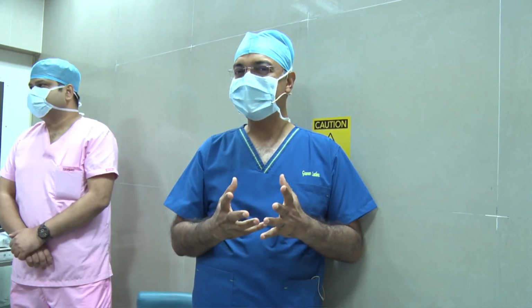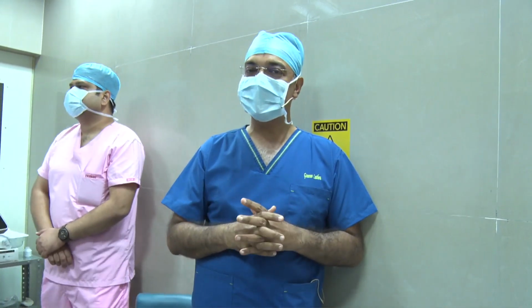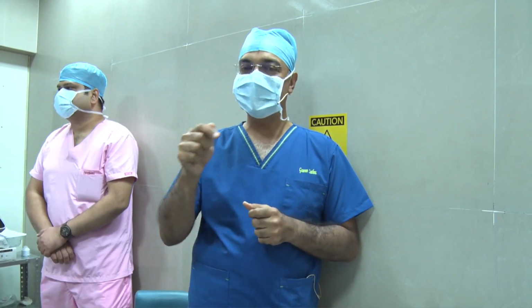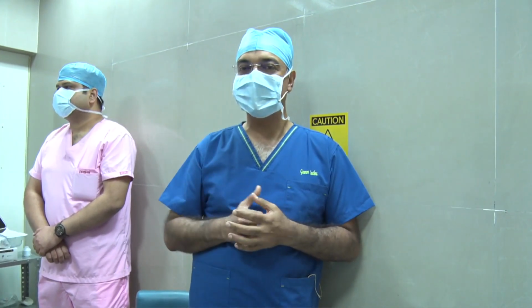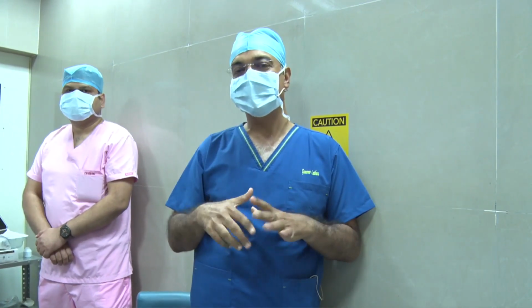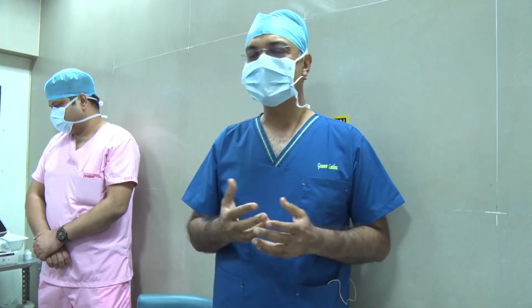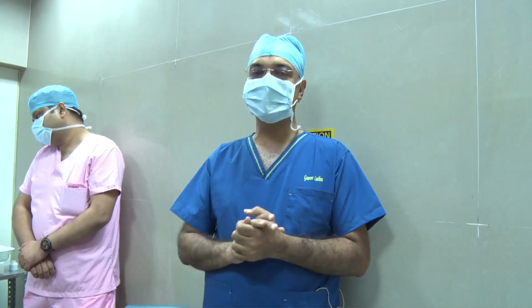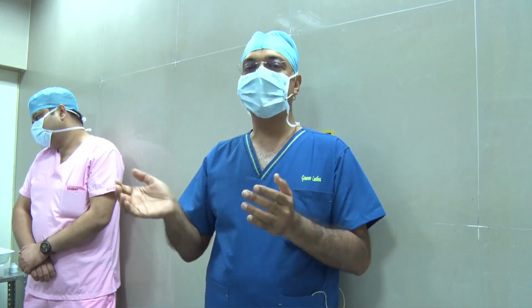And pseudoexfoliation eyes, again very shallow chamber eyes. Some of these highly hyperopic eyes which have very shallow chambers, while doing the rexis you may have problems with iris prolapse and all. So there again it's very useful because you can have a rexis without actually opening the eye. So many of these indications, again intumescent cataracts, as I said, the rexis is over in 1 second. So there is no risk of the runaway happening.